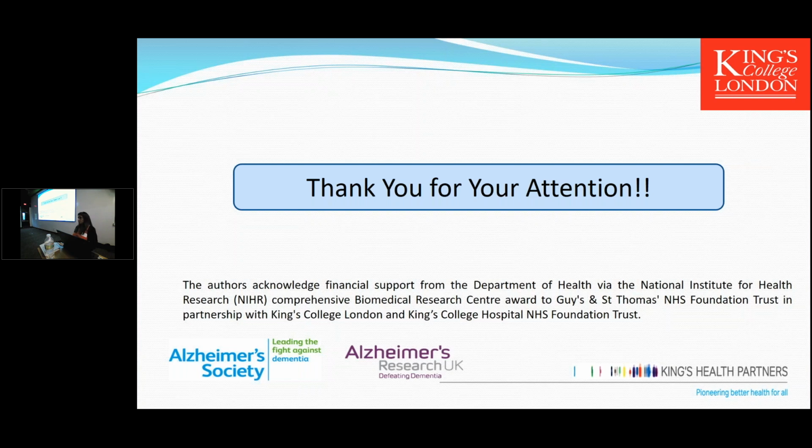But I do know that this particular software is also being used to look at tumor models in mice, so comparing vivaquants in tumored mice versus texture analysis, but it hasn't been published yet. But originally, the software was developed to look at clinical images by the authors who are actually clinicians, and they want to look at better ways of evaluating FDG uptake in a tumor. And so in a way we're going backwards from the clinical to preclinical.